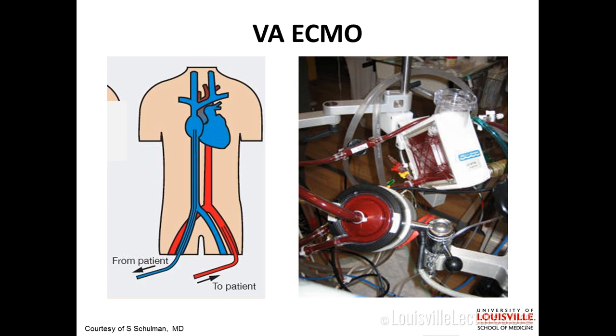There's a couple of problems with VA ECMO or VV ECMO. So the problem with VA ECMO, if I'm using this for someone who comes in with a massive MI, for example, I had a patient, massive MI, VSD, crashing and burning. Needs circulatory support, trying to die. So we do VA ECMO, but remember that I'm delivering the blood here.